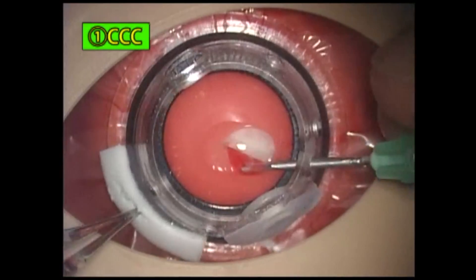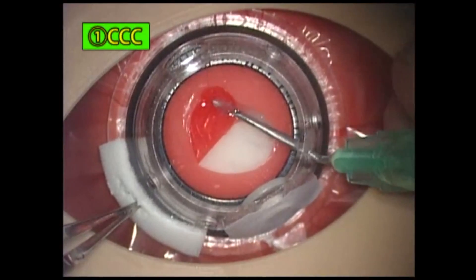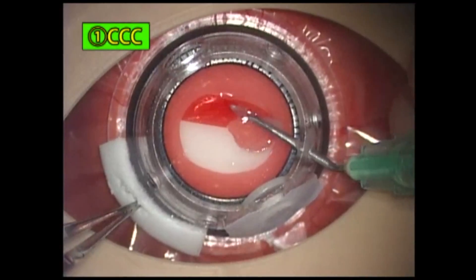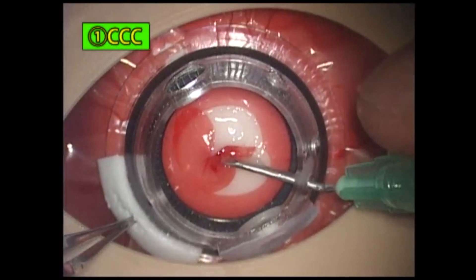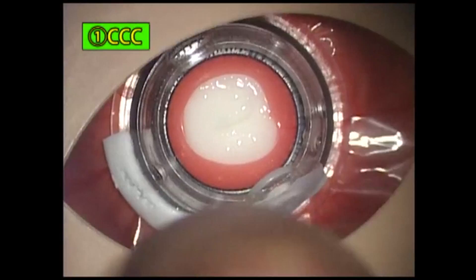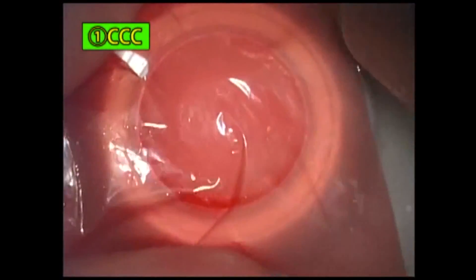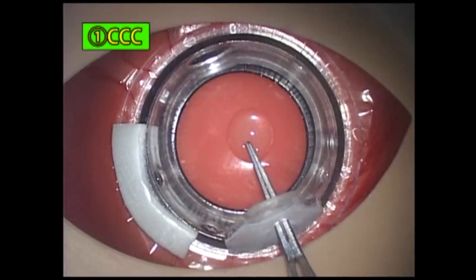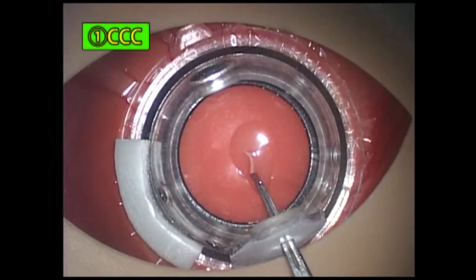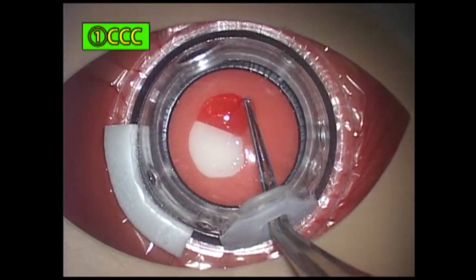CCC is done with a cystotome. After practicing each of the operations, slide the film for the next operation. Smooth the surface of the clay with your finger on the film and repeat the setup as before. This shows an experienced doctor's CCC using forceps. Inexperienced doctors cannot perform the operation so well and will make similar mistakes with the film as with the human eye.